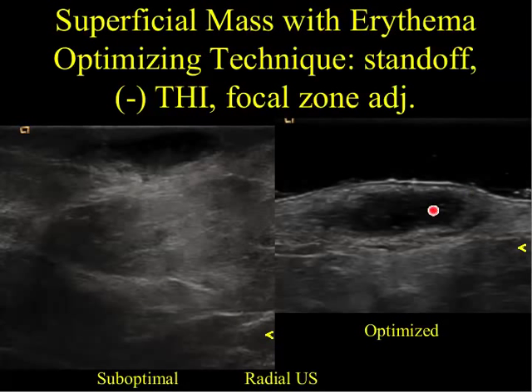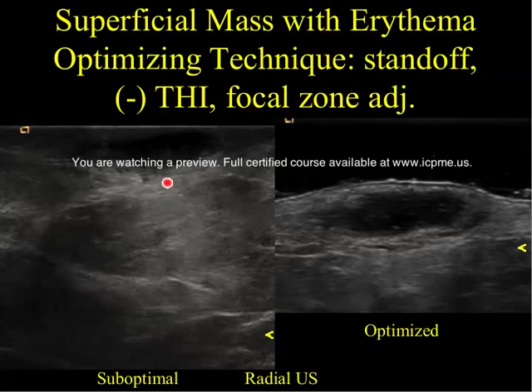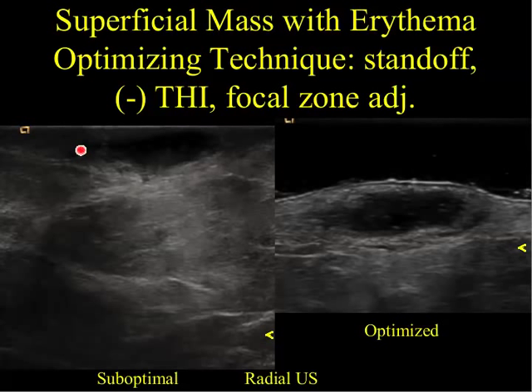Here's an example of a superficial mass with erythema that is not optimally imaged on the left, but we've improved the image to the right. On the left-hand image, we're using tissue harmonic imaging and the focal zone is down in the far field, but what we want to image is higher up. To make this image more diagnostic, let's start by putting a standoff pad on and bringing the focal zone up to the skin line, so now our focal zone is at the posterior aspect of the abnormality.